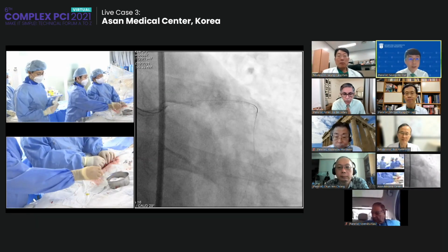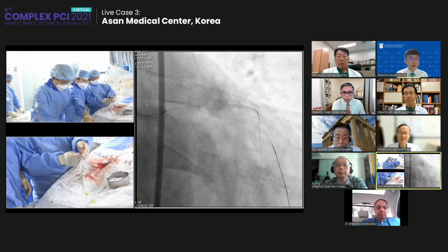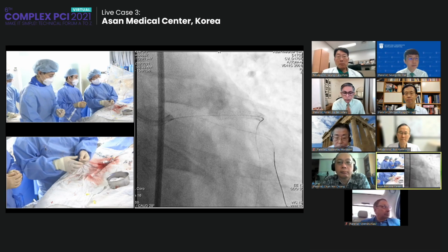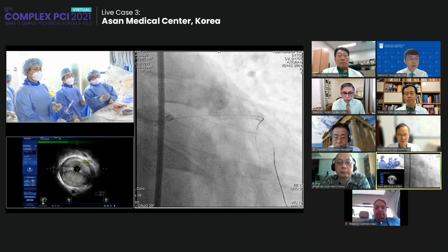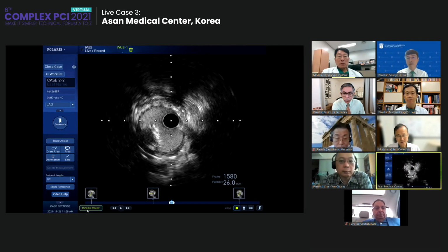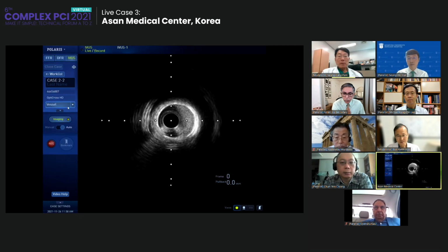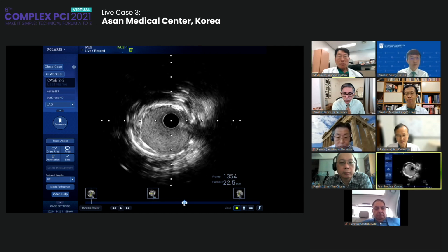Okay. Good. Are you planning to IVUS the diagonal also? Yes, diagonal IVUS. Is the previous IVUS the pre-interventional IVUS? Yes, pre-interventional IVUS. This is a very unexpected finding: the coronary angiogram looks very fine, but IVUS shows some thrombus inside of the stent. Would you show us again? Can you see the thrombus? Just before, that one? Yeah. Looks like thrombus. And a little further. Play. Thrombus, yes.